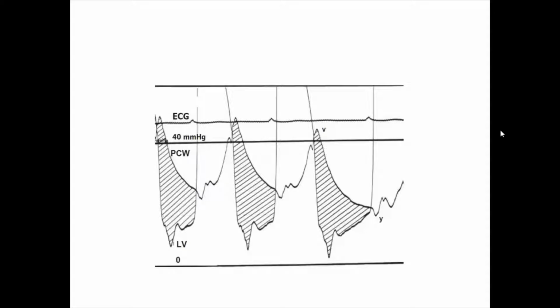What other? Yeah, you did well. So let us be more systematic. I need it descriptive. What we see, we have to have a protocol, for example. And I suggest for you to start usually with hemodynamics, either simultaneous hemodynamic tracing or, for example, pullback. Simultaneous means what? We are recording hemodynamics from two chambers or a chamber and a vessel at the same time, simultaneous. Or we are using two catheters at the same time.